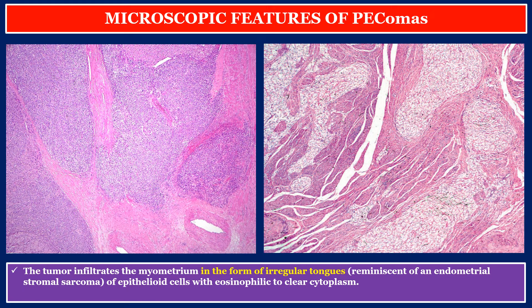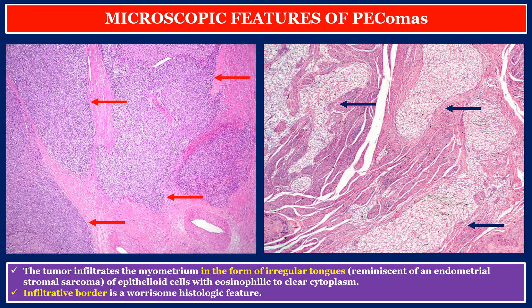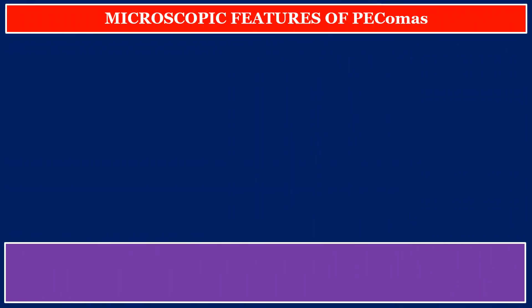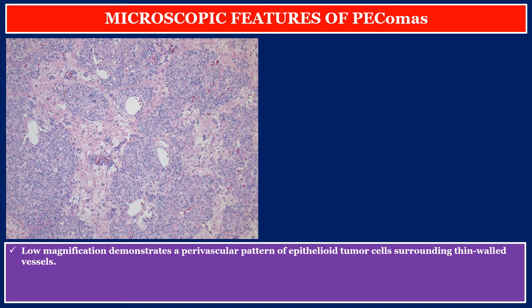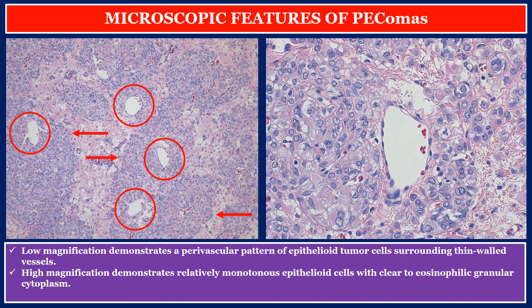Microscopic features of PEComas. The tumor infiltrates the myometrium in the form of irregular tongues, reminiscent of an endometrial stromal sarcoma, of epithelioid cells with eosinophilic to clear cytoplasm. Infiltrative border is a worrisome histologic feature. Low magnification demonstrates a perivascular pattern of epithelioid cells surrounding thin-walled blood vessels.